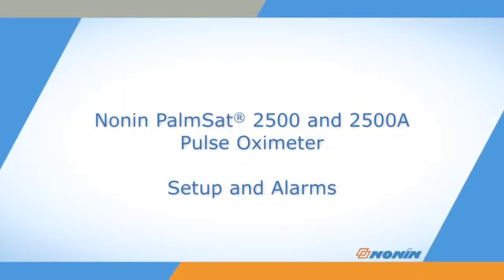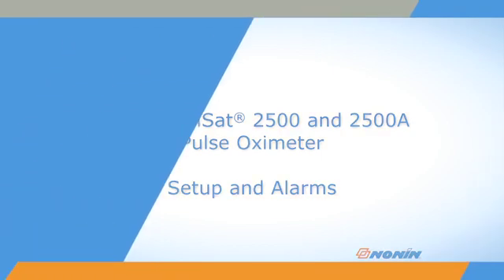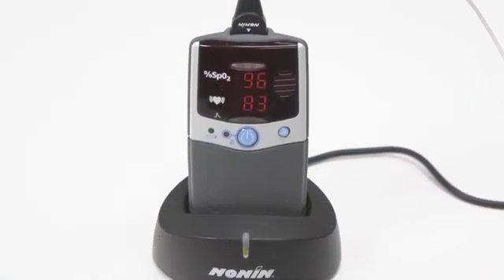This short video shows how to set up and adjust settings on Nonin PalmSat Model 2500 and 2500A Pulse Oximeters.